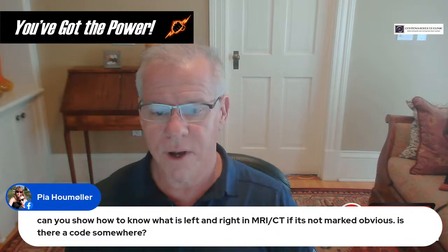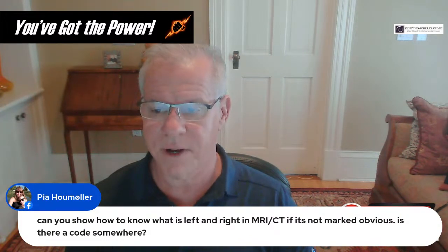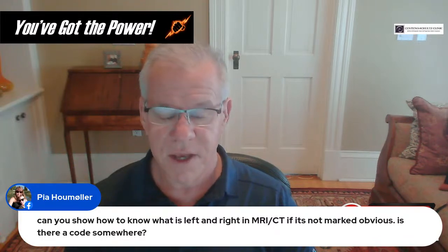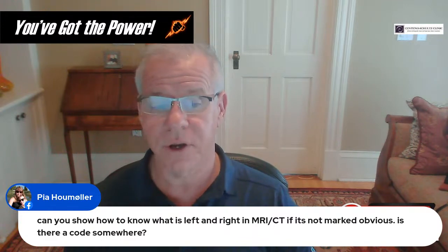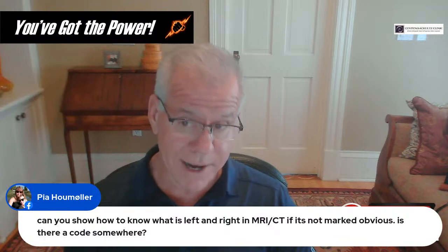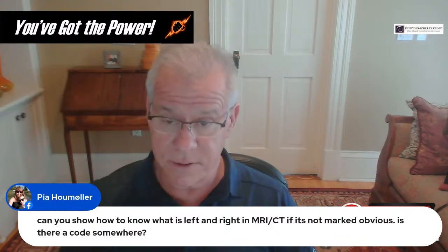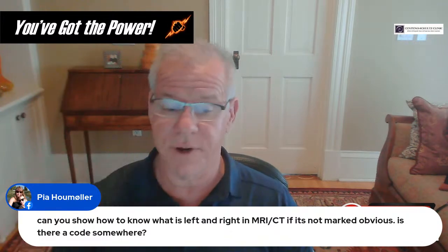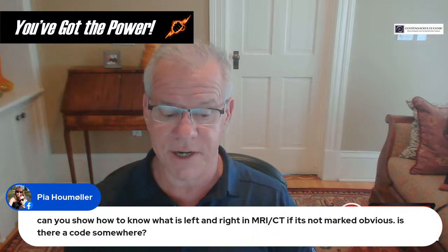Pia, can you show how to know what is left and right in MRI? If not marked obviously, is there a code somewhere? Pia, that is a good question. It's backwards. The left of your screen is always the right of the patient, and the right of the screen on an axial, meaning we're looking at the top-down view, is always the left of the patient.